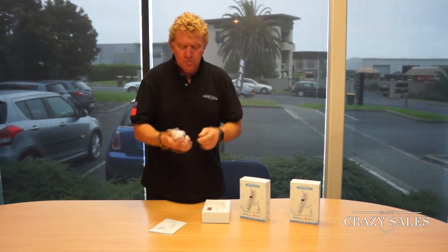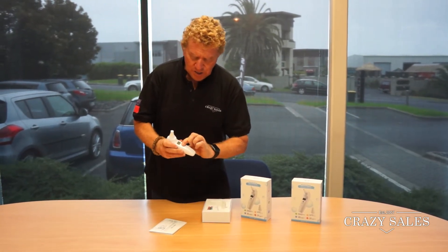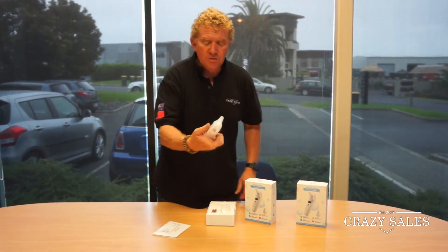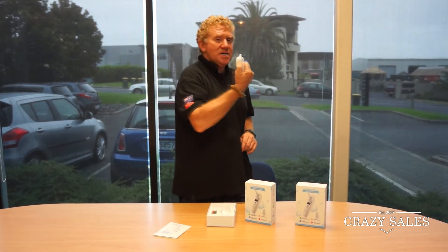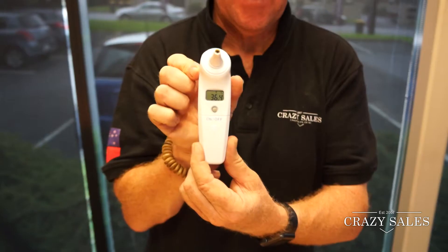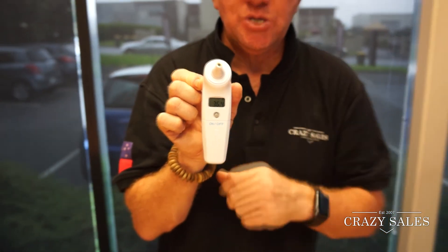All you do is put the batteries in here and turn it on. Once you hear the beep and it's on, press the button at the back — take the cap off first of course — then stick it in your ear, press the button back, and just hold it in there for a few seconds. You can see the temperature here, and once you take your finger off the button it displays the temperature.